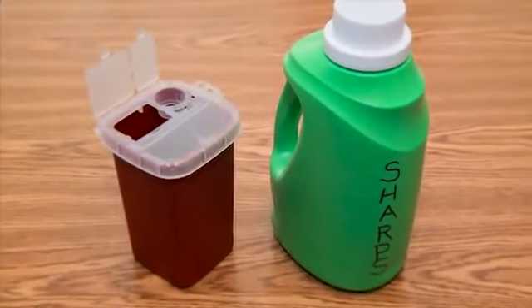Place used insulin syringes and lancets for blood sugar testing in a hard plastic or metal container with a screw-on or tight lid or a commercial sharps container.